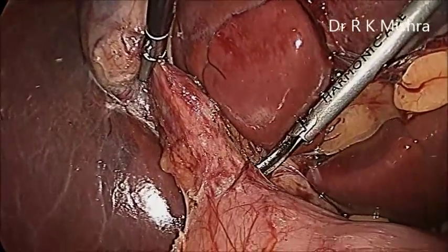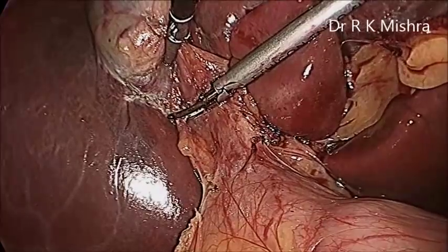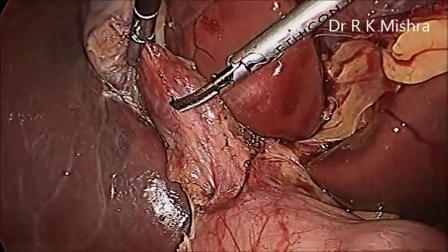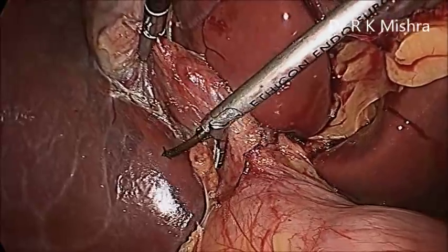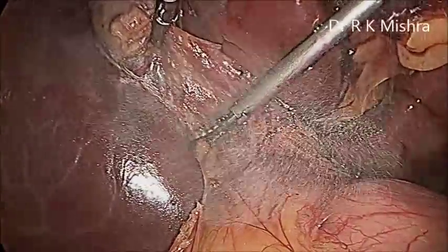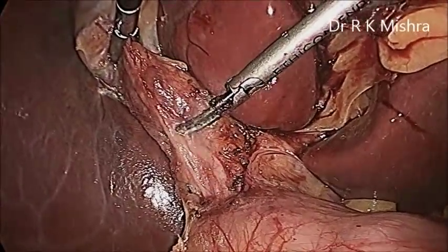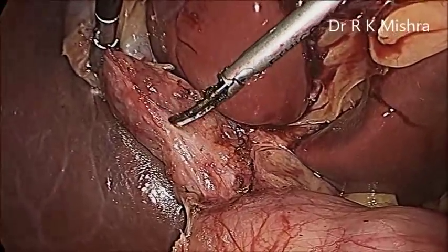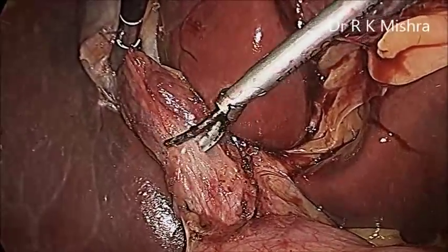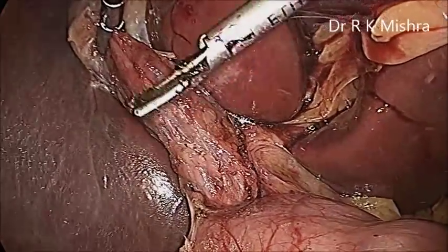The stripping technique of the harmonic is very good, because once it vibrates at 55,500 vibrations per second, after breaking of the hydrogen bond it forms a plane of dissection, and that's why it is a good dissector. Actually it is the dissector of choice for me generally, but it is an individual choice. Many people like to do it with the help of a hook, spatula or scissors. Here it is very important that the vibrating tip should be visible and the silicon should be behind, otherwise there may be bleeding. This is a good fibrous tissue only. It's separated.